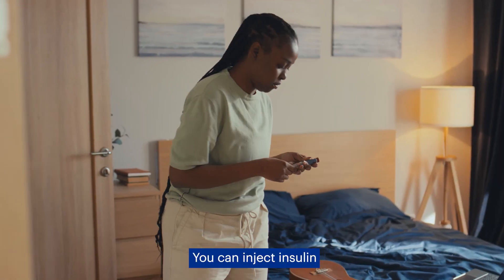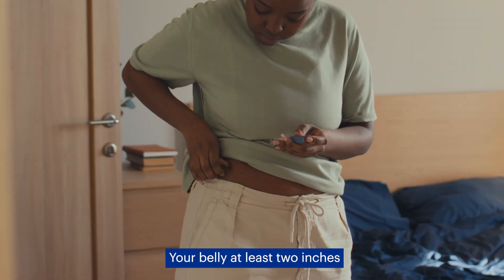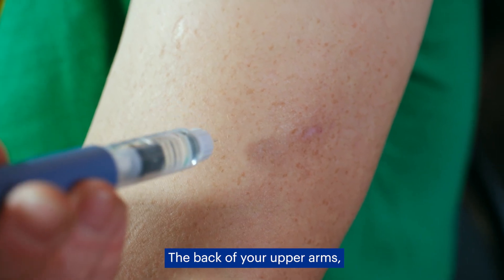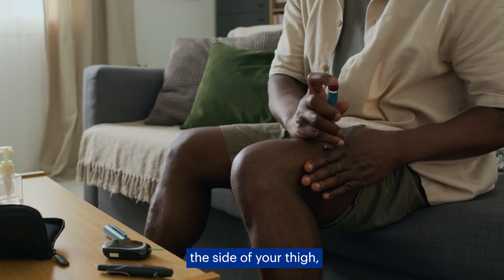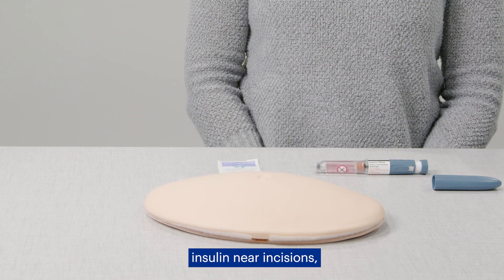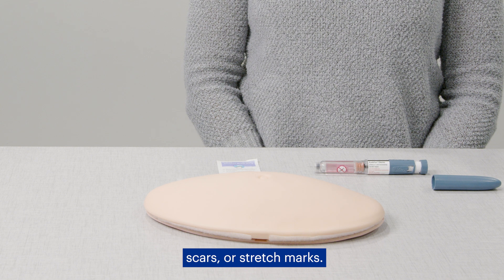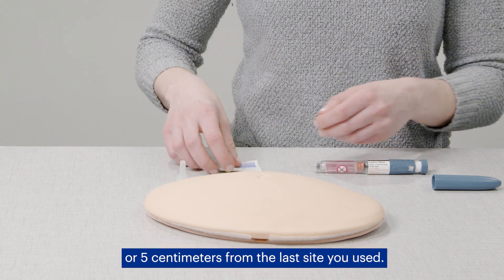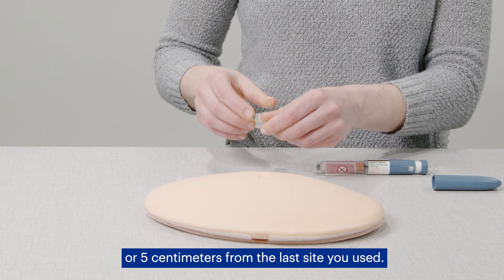You can inject insulin in the following places: your belly, at least two inches from your belly button; the back of your upper arms; the side of your thigh; or your upper buttocks. Don't inject insulin near incisions, scars, or stretch marks. Each injection should be at least two inches or five centimeters from the last site you used.